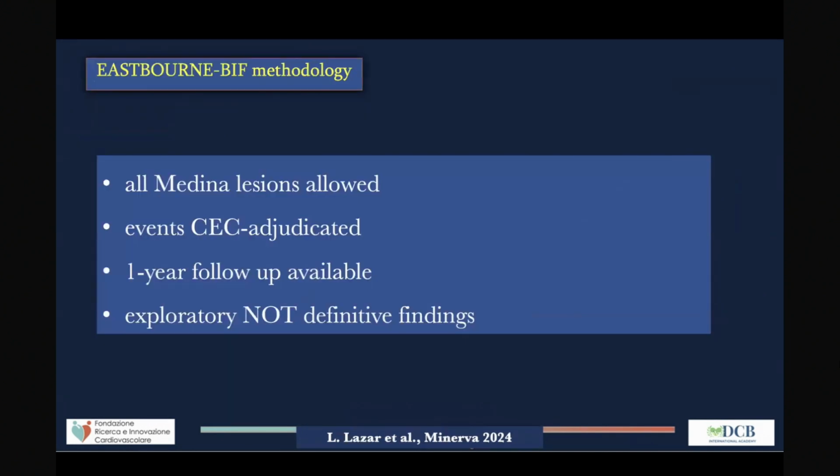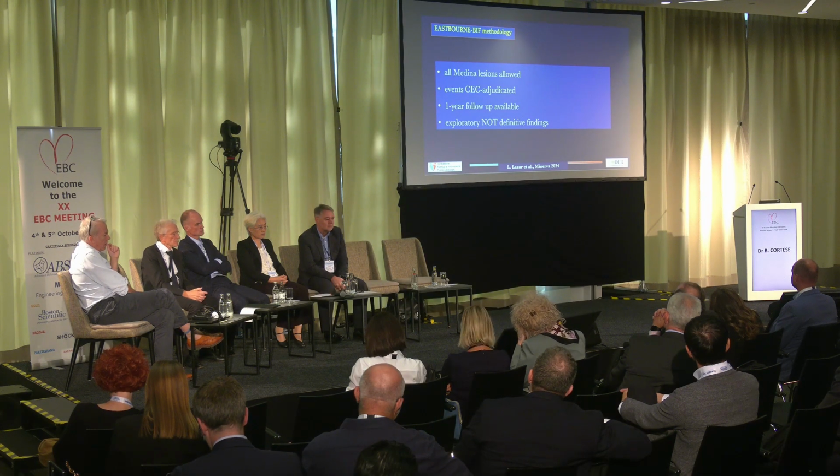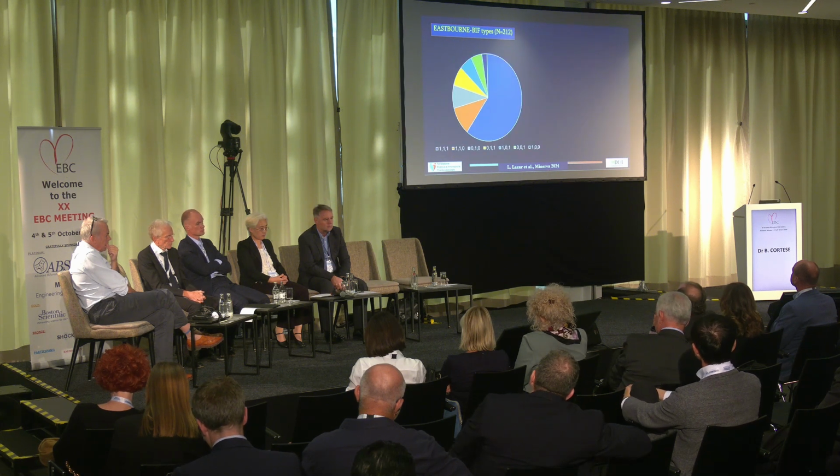We have a pre-specified bifurcation study within the EASTBOURNE, where all Medina lesions were allowed according to the preferences of the physicians. All the events have been CEC adjudicated. We have 1-year follow-up available for this sub-analysis, but these are really exploratory, not definitive findings.